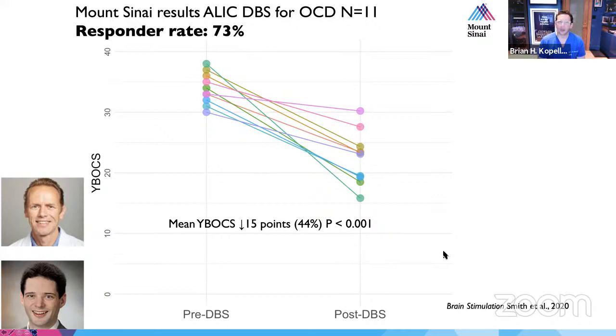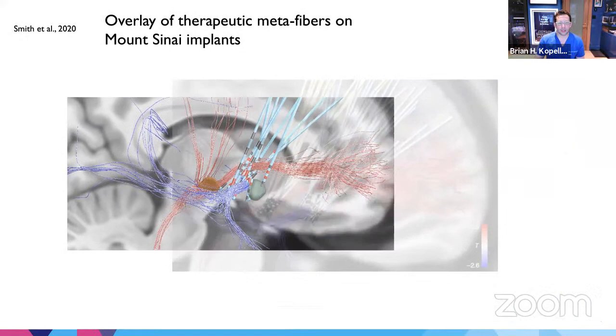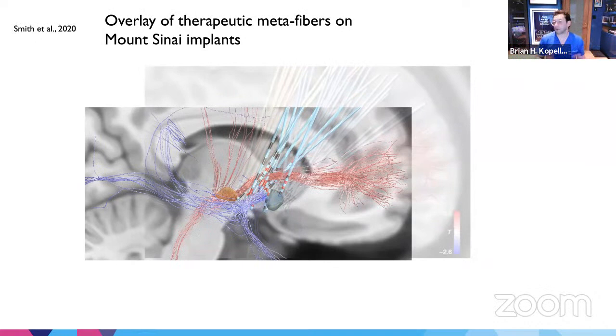But we'd like to figure out, well, is this just a statistical abnormality? Or is there something else behind here that we could leverage going forward for patients? On the right-hand side is, once again, that diagram of the responders and the non-responders in relation to these two tracks. When we laid our cohort onto this same schemata, what was interesting is that our leads tended to be in between these two cohorts for whatever reason.